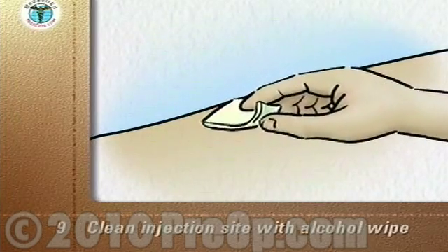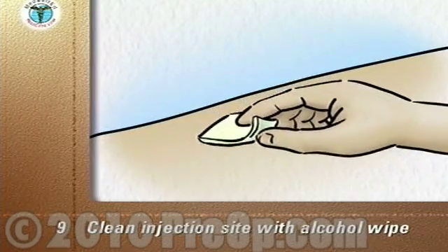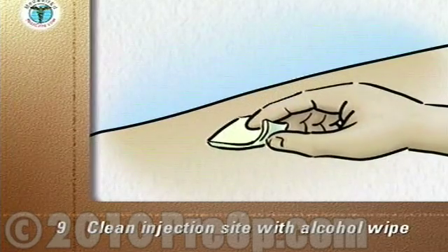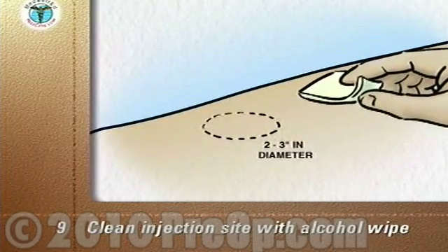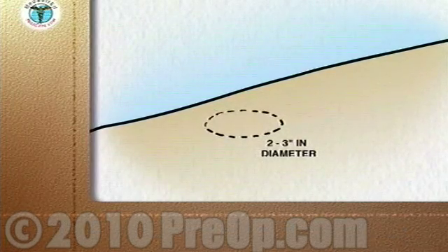Clean the injection site with an alcohol wipe. Start at the proposed site. Wipe in a circular motion, moving outward with each circle to prepare an area 2 to 3 inches in diameter around the injection site. Let the alcohol dry and discard the wipe into the trash.